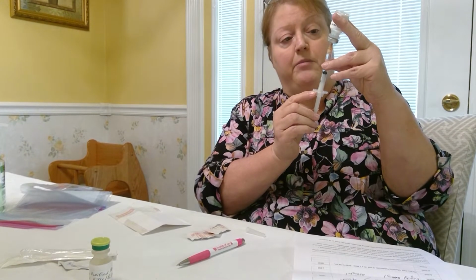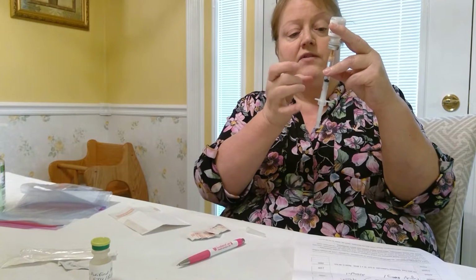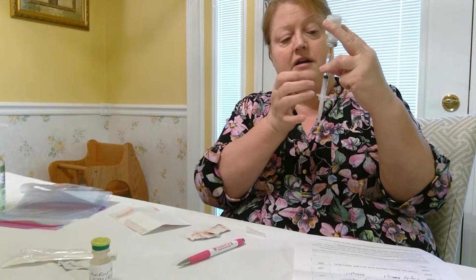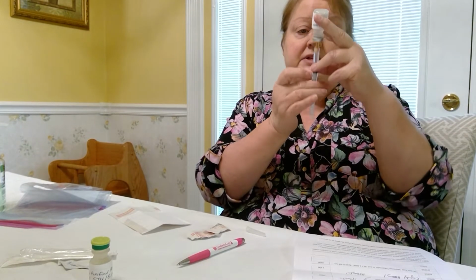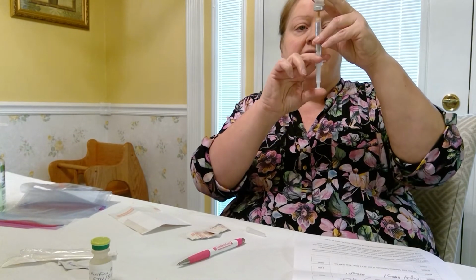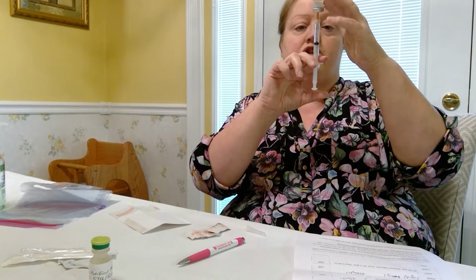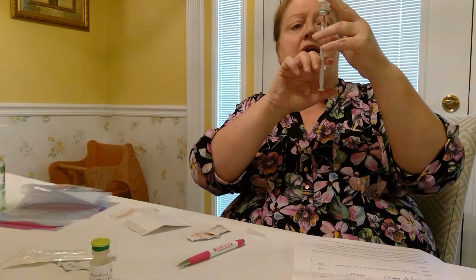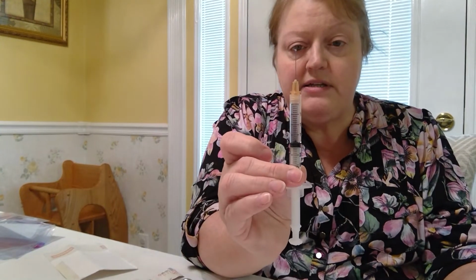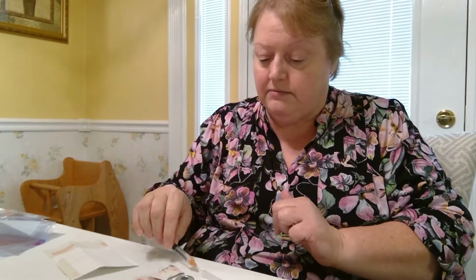I'm going to draw up slowly 2 milliliters. I see I have an air bubble at the top and at the bottom. Carefully flick your syringe to get the air bubble up to the top. Pull back more than what you need. And then as you inject back to the 2 cc or 2 milliliter mark that you need, it will have expressed your air bubble into the bottle. Carefully pull it out. Turn and demonstrate to us that you have 2 cc's and that there's no air bubble. Scoop your cap.